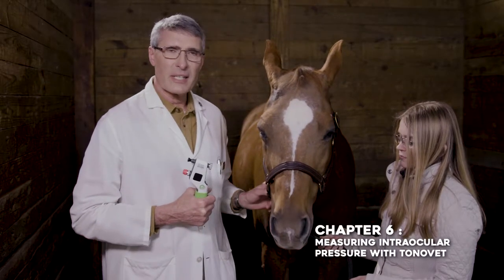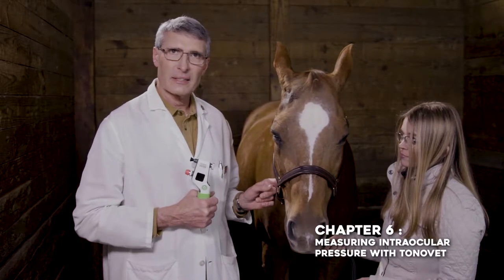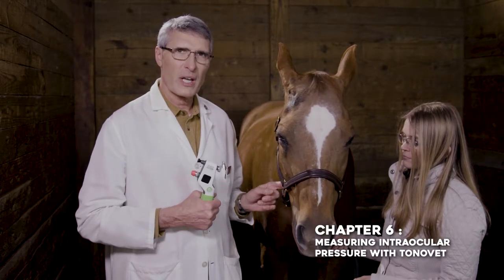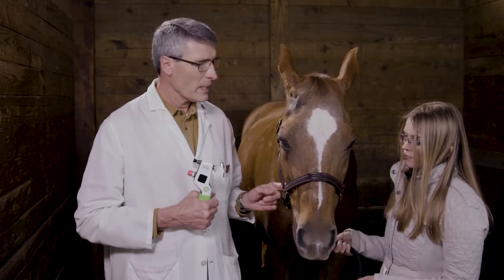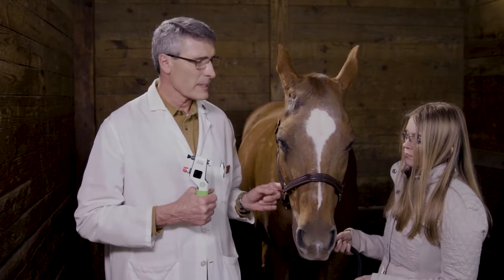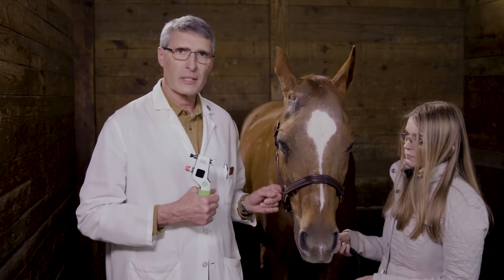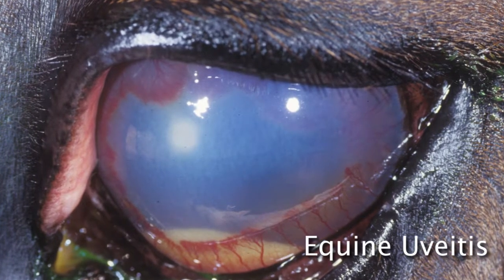Now that we have completed the detailed extraocular examination, this would be a good time to check intraocular pressure. Intraocular pressure is pretty important in the horse to diagnose low intraocular pressure, which would be seen secondary to uveitis, which is a common disorder in horses.